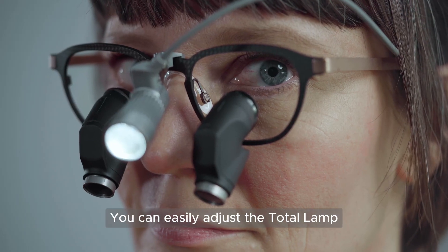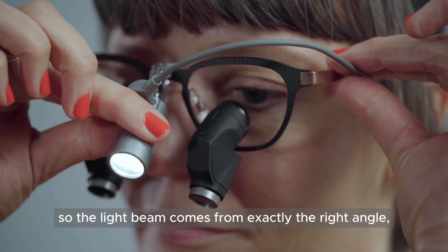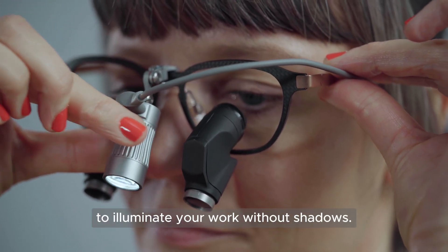You can easily adjust the total lamp with its extra coaxial attachment, so the light beam comes from exactly the right angle to illuminate your work without shadows.